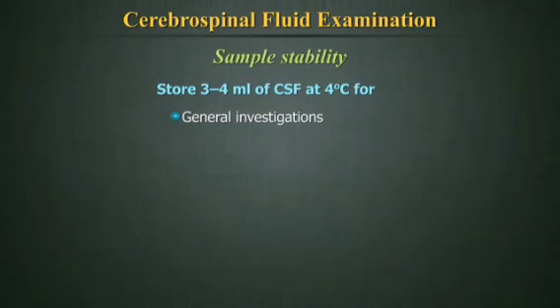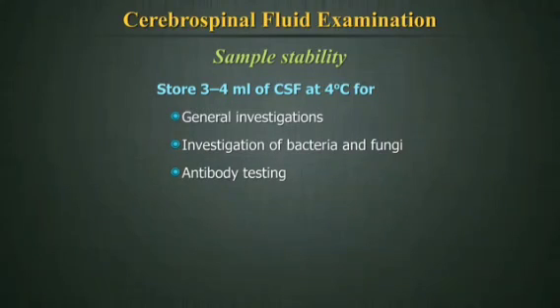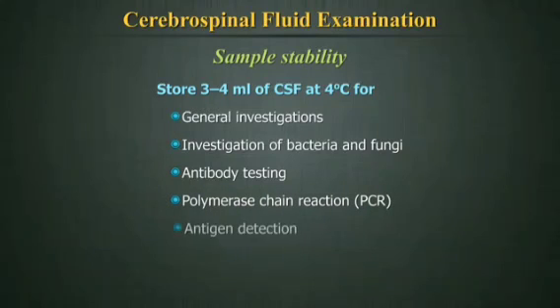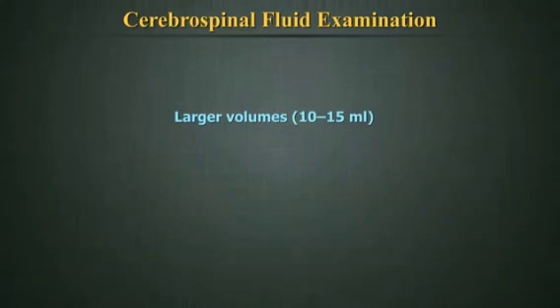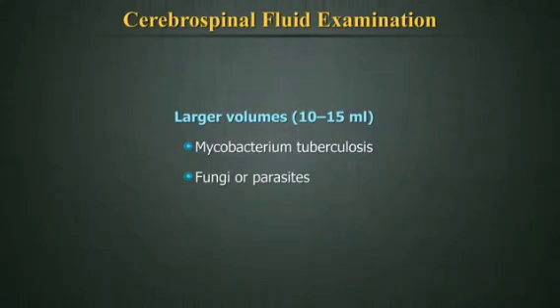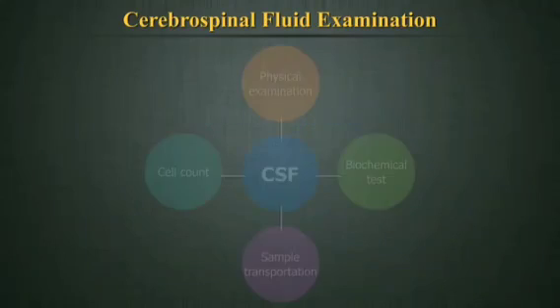General investigations, investigation of bacteria and fungi, antibody testing, polymerase chain reaction, and antigen detection. Larger volumes, 10 to 15 milliliters, are necessary for certain pathogens like Mycobacterium tuberculosis, fungi, or parasites.